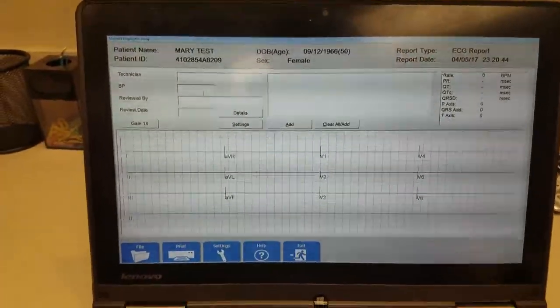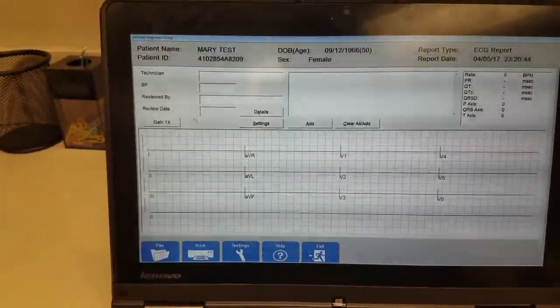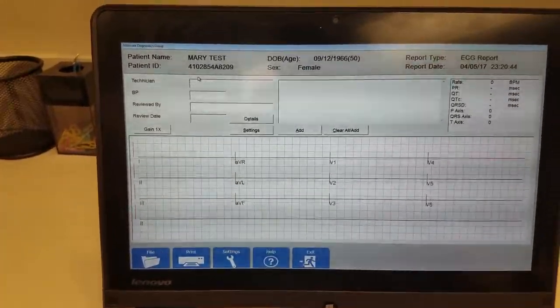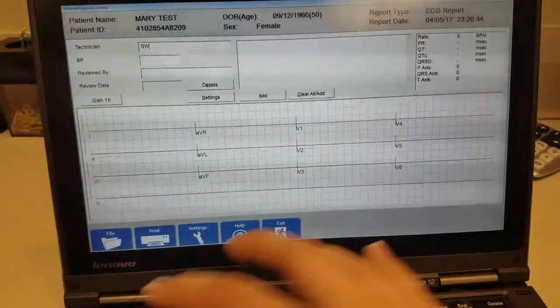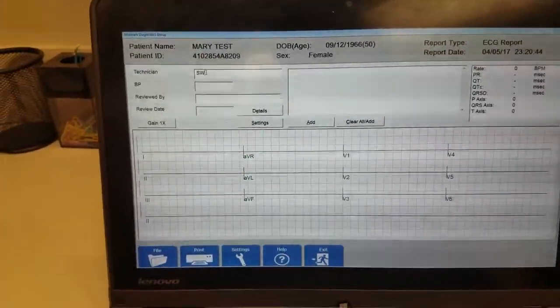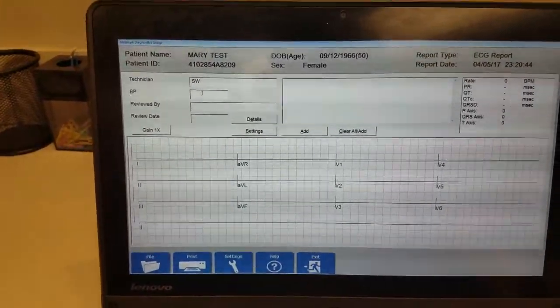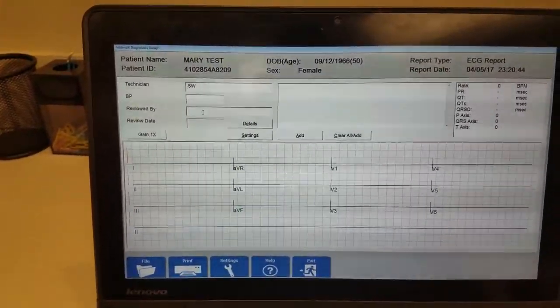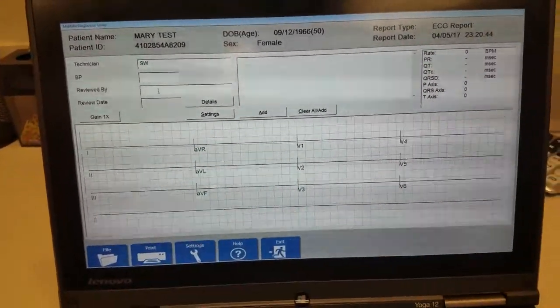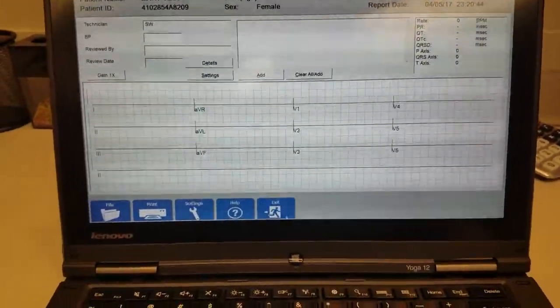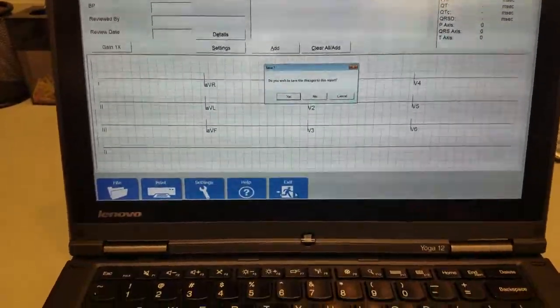In this section, the only thing you're going to do is put your initials or name. You don't have to put the blood pressure or reviewed by. This would show some activity. Then you're going to hit exit.